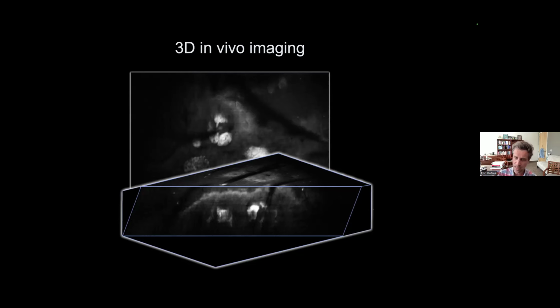You can do depth-dependent imaging, and you get this beautiful real-time recording of what's happening inside the skin of this mouse. So this is the first real video rate imaging demonstration of this kind of coherent imaging. People thought it cannot be done. It's too exotic, but it turns out it's actually perfectly fine. And in some cases, this is really the only way to do it.